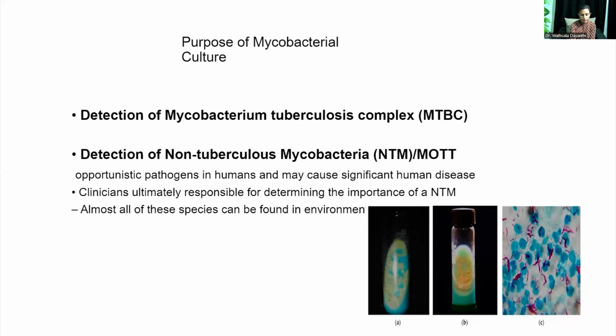So some words about this MOT or mycobacteria other than TB. Unlike MTB complex, these MOT are common environmental pathogens. So detection of MOT in a culture should be interpreted clinically, and of course, they can cause opportunistic infections in certain patient groups. So this is a picture of MOT growing in LJ medium.